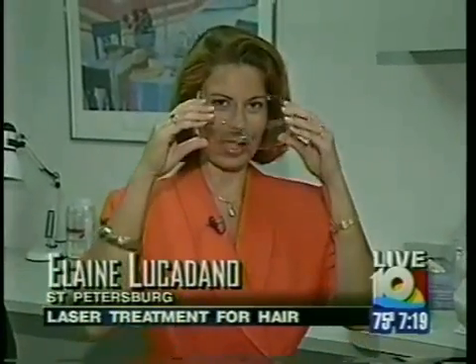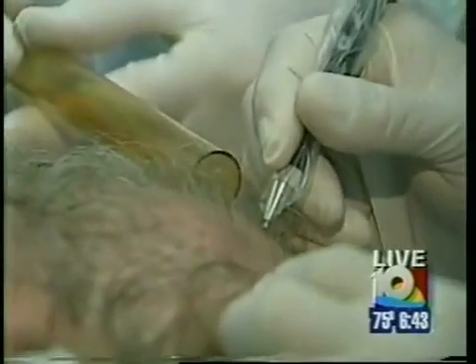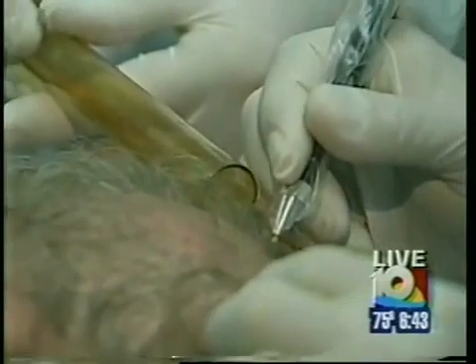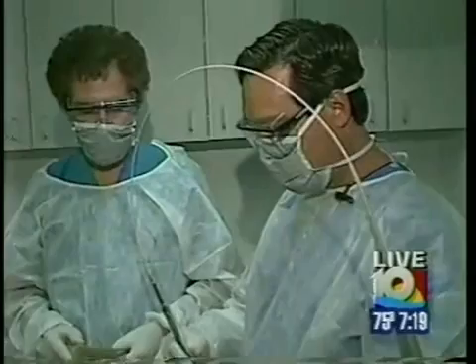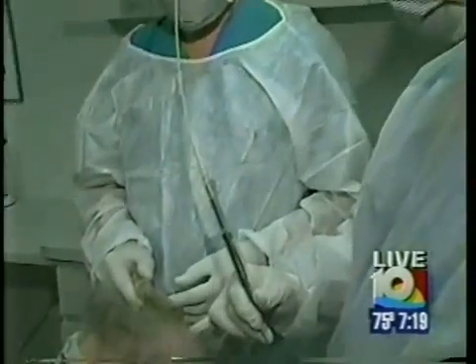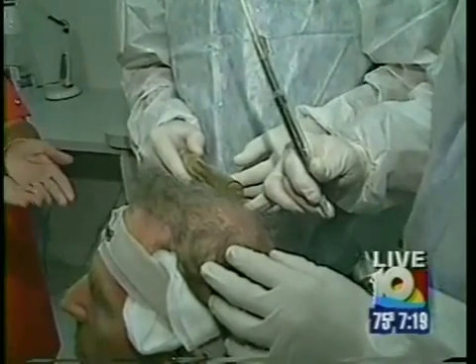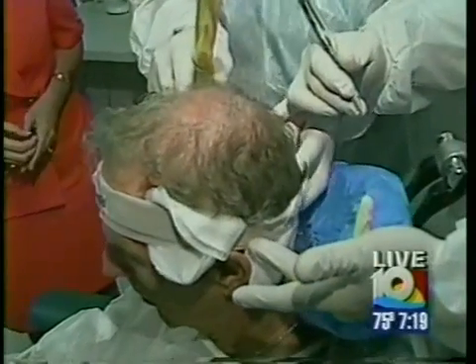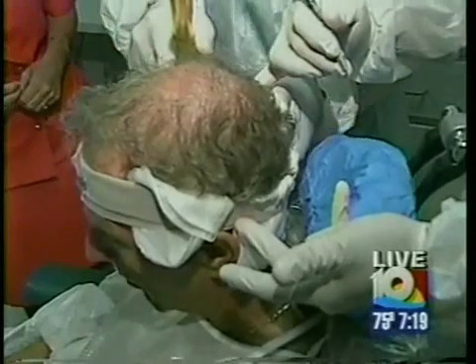Hi, Elaine. Hi, Dave. Hi, Jennifer. Time to put on the laser glasses because I am witnessing, along with you this morning, up close, laser hair replacement. Give us an idea of how this works. Well, what we're basically doing now is using a laser to make recipient sites. They're about 0.8 millimeters, and then we insert a little graft that has 1 or 2 hairs into it, and within a couple months the hair starts to grow. And you take the hair that's already on the head from a thicker area. We take the hair from the back between the ears, and we know that's a genetically stable hair, and will continue to grow for the patient's life.